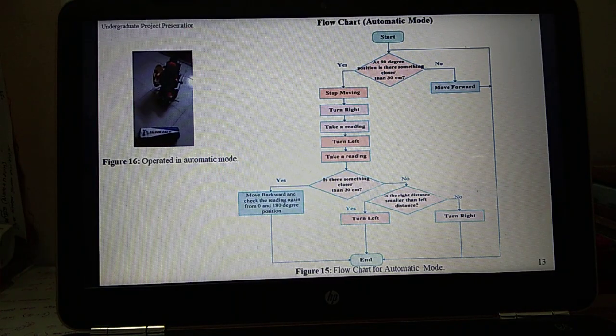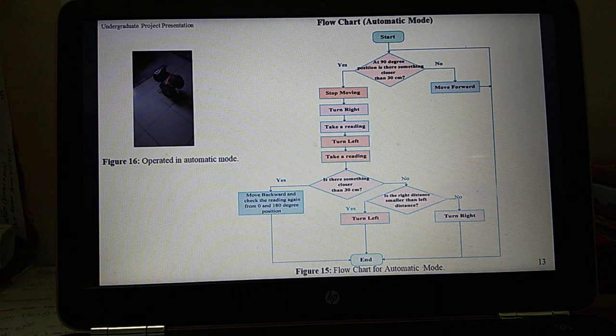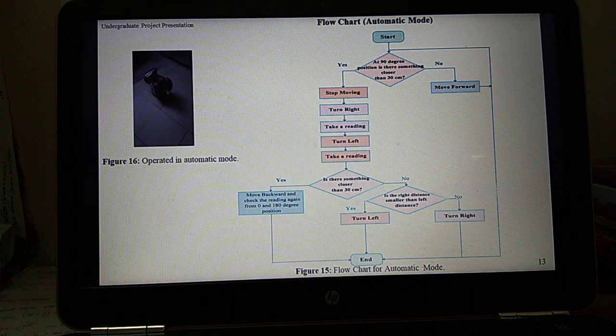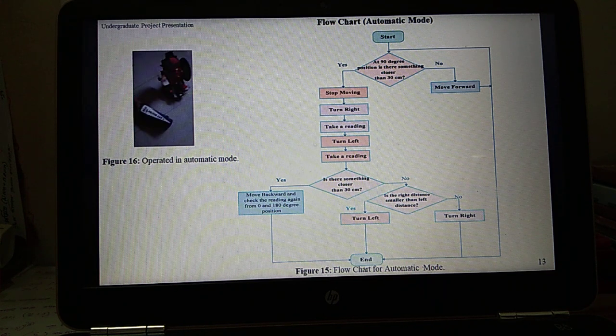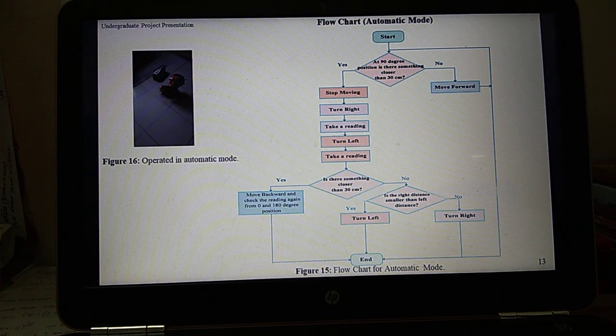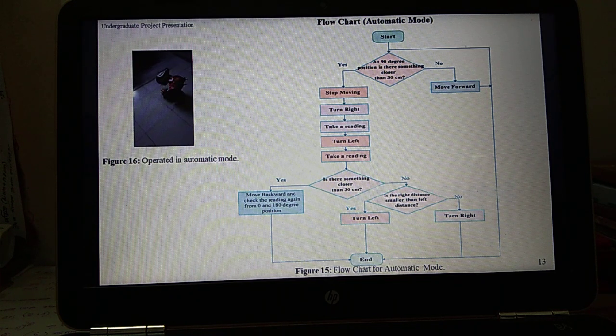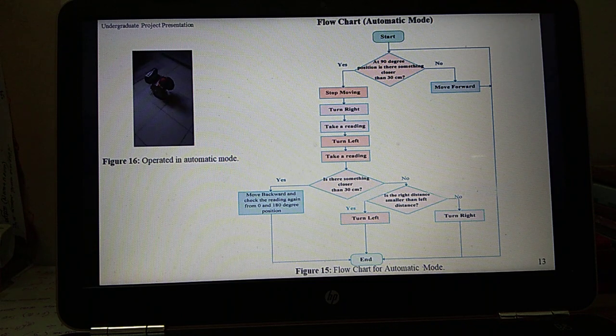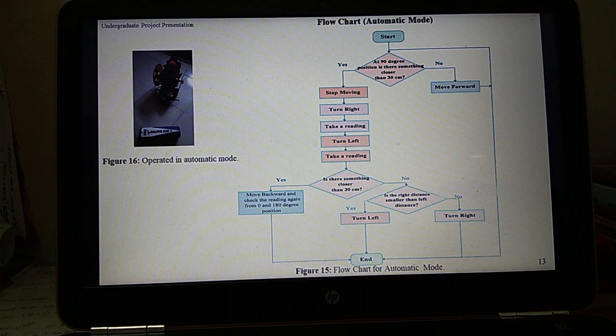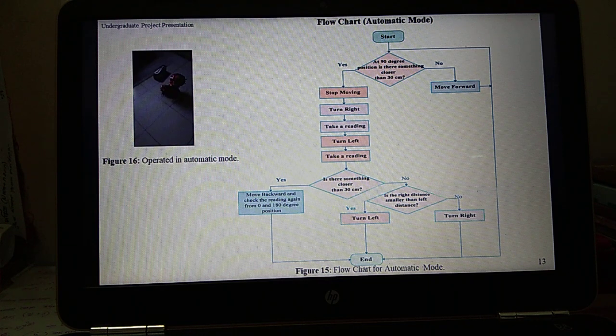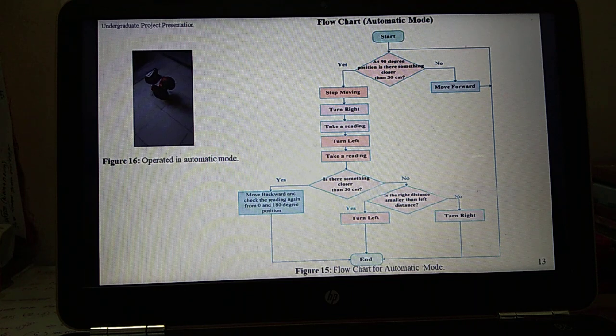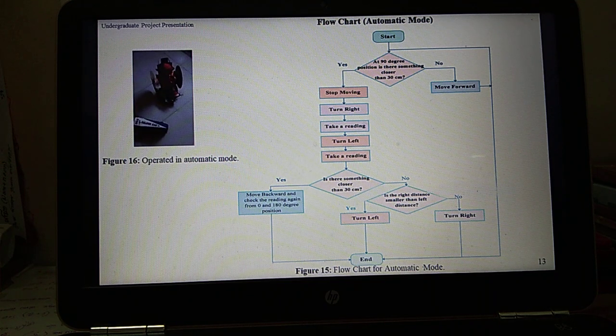If the reading from the sensor at 90 degree position is less than 30 centimeters, the wheelchair stops moving forward and starts taking the readings at 120 and 60 degree positions by tilting the servo. The position of the servo will be at 90 degrees at the beginning. If the reading from the sensor at 90 degree position is less than 30 centimeters, the wheelchair will stop moving forward, then it turns right and left by rotating the servo. These readings are then compared and the wheelchair will turn to the side where the reading is greater.